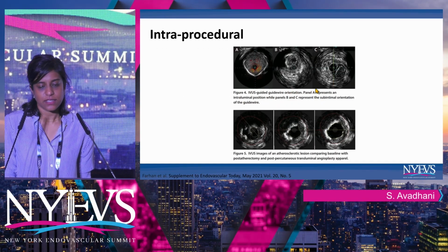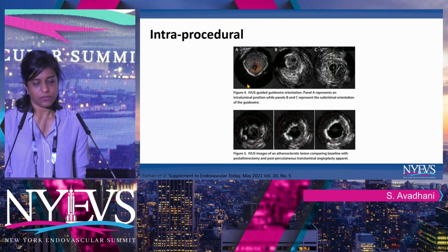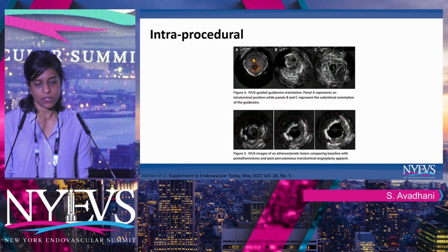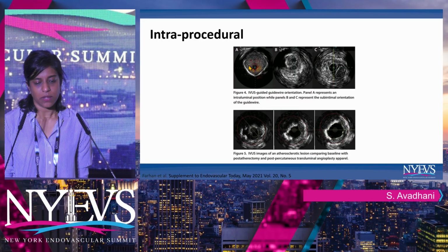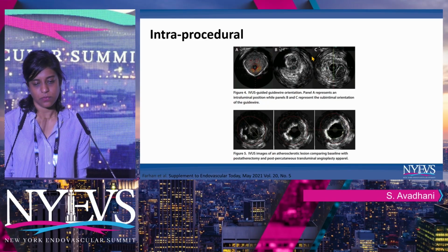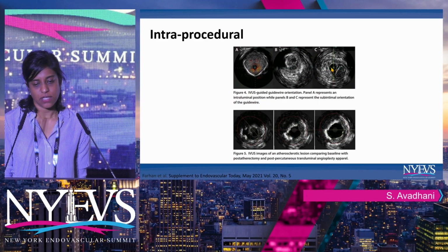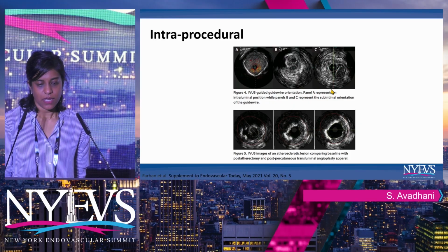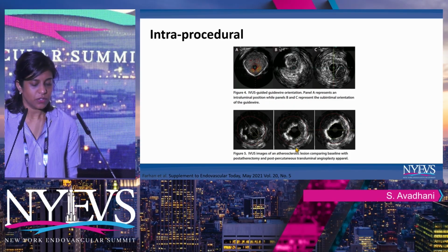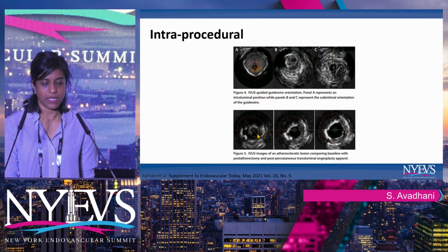This is a case that we published from Sinai, where we showed the use of IVUS during a case. Here you see our guide wire position within the lumen versus in B and C, where we used a subintimal crossing technique, and you see that your guide wire is subintimal and not true luminal. And here it's also useful to gauge our treatment modality.